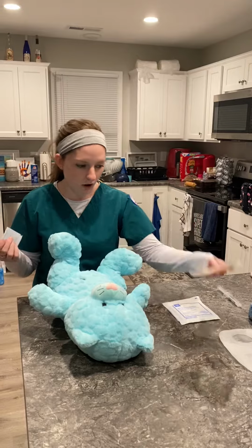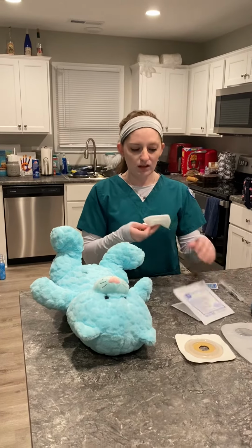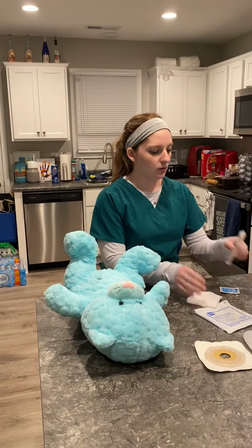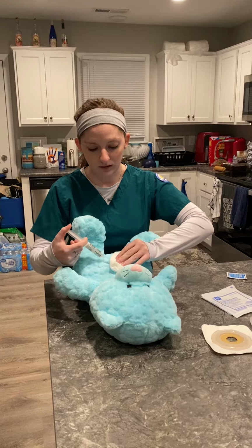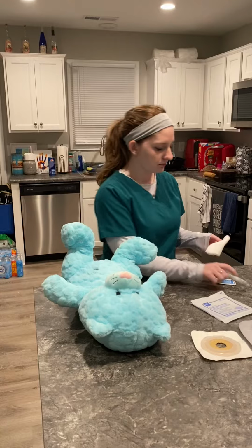Well, you take the whole thing off, but you would just go around the edges, working your way around and gently pull that off. So now what you do is you take some gauze with warm water and wipe the stoma clean. So then you can take a new gauze, irrigate the stoma, and this just helps to regulate the bowels.